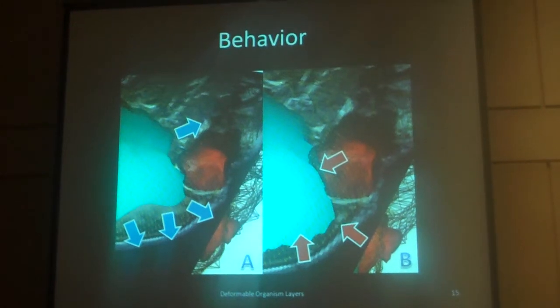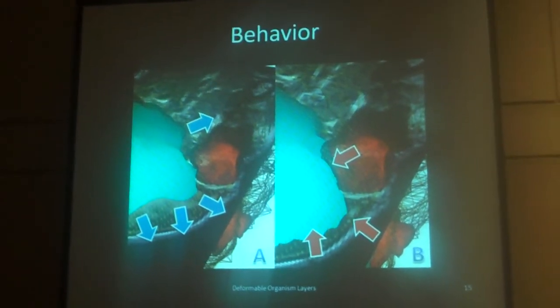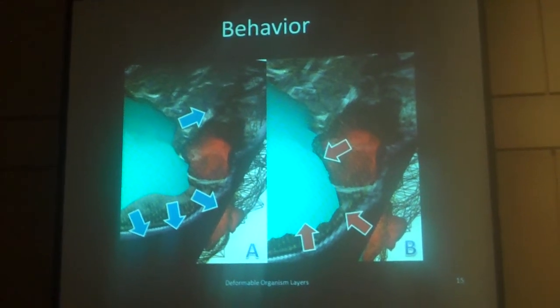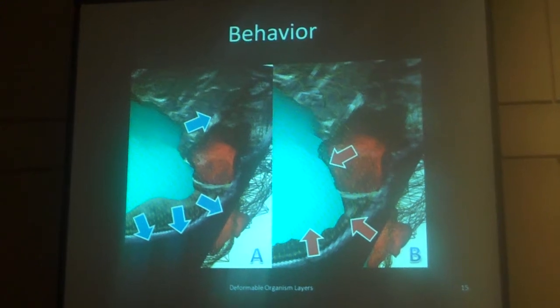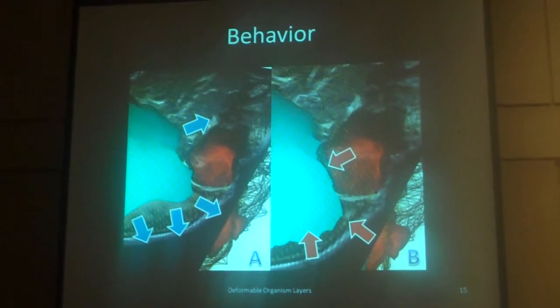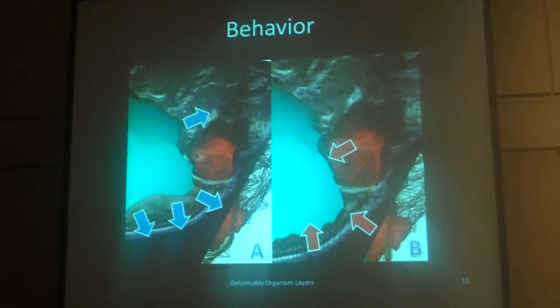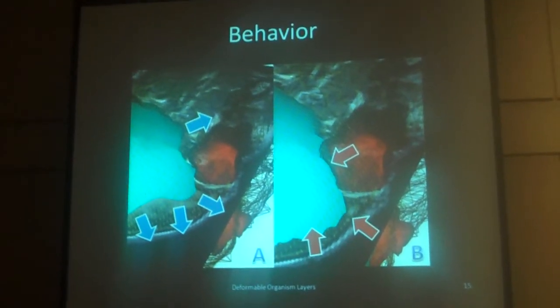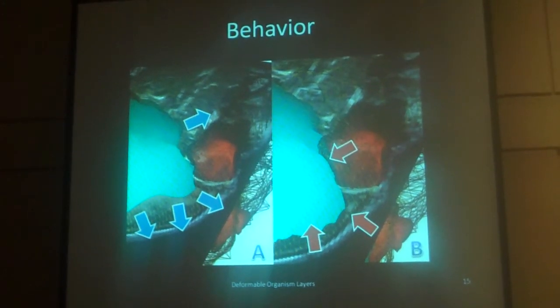Our behavior layer is where we specify how we analyze the intensities along the normal lines at every vertex in the mesh. It can be designed so that the organism is attracted to certain features or landmarks in the image, or it can use that information to understand where it is located in relation to all the other organisms.